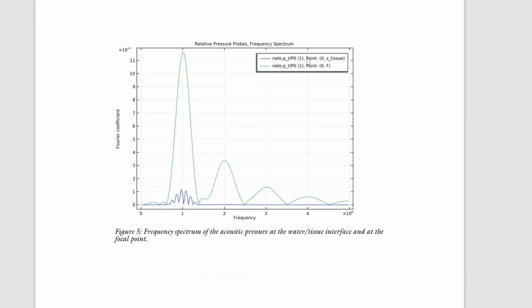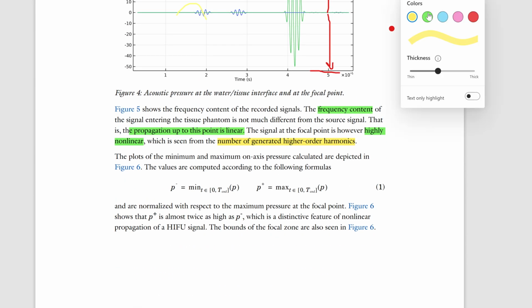Okay, so blue's tissue. Here we go. We have one here focused around this point, high at 1, 2, 3, and these are our harmonics. Fourier coefficient. These are our harmonics because it's going 1, 2, 3, 4, bump, bump, bump, bump, and this should keep going like this until it decays out. But if you know about a Fourier coefficient, these are substantial. This is one pattern, but this pattern is just around 1. Okay, so now we've answered that. Number of generated higher order harmonics, we have seen those.